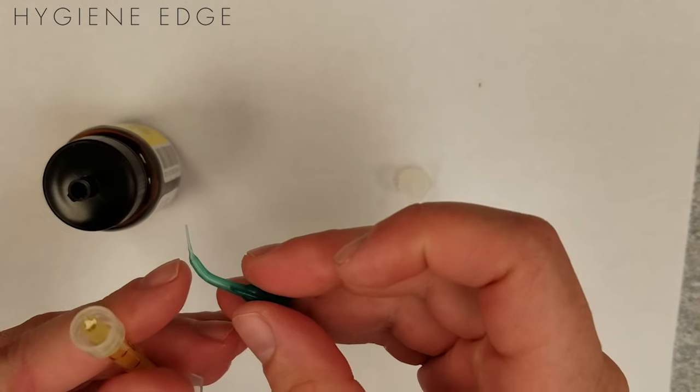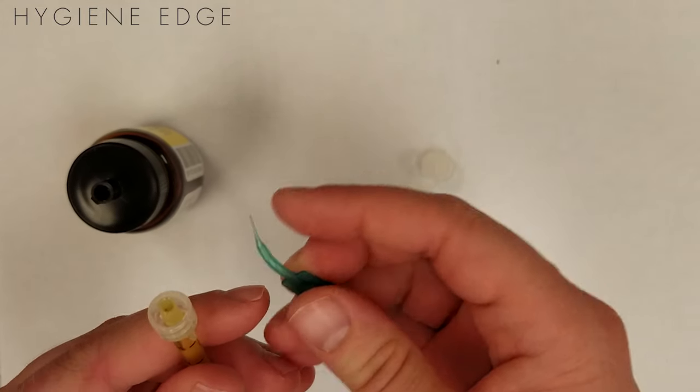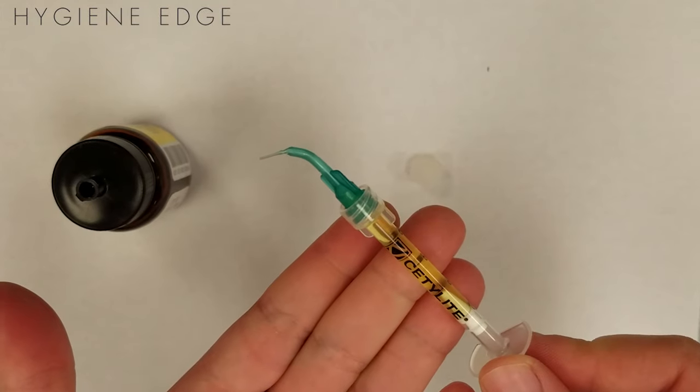You can custom order these syringes and tips based on your personal preferences. Make sure, too, to replace the port cap on the bottle so that it doesn't spill, because it is about $80-ish per bottle.